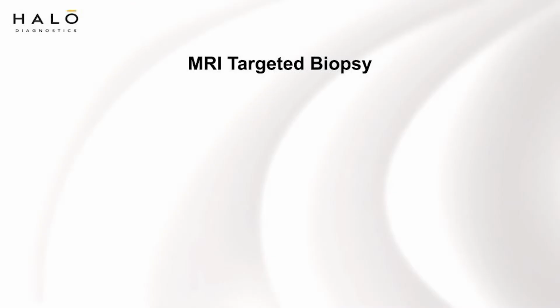Now, if a patient has an elevated serum PSA, which is the screening blood test for prostate cancer, and they undergo the new type of MRI of the prostate, a multiparametric MRI, if we see a suspicious abnormality, rather than doing a random biopsy, we do what's called an MRI-targeted biopsy. This can be done two ways. One way is called an in-bore MR-guided biopsy.